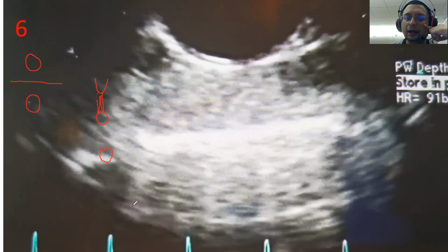But this time it will move the same way. If this structure moves there, this other structure also will move there. So that is reverberation. In mirror artifact, there is another structure that becomes the mirror and the image moves the opposite way. In reverberation artifact, you yourself are the reflector. And because the beam travels twice, once is your image, and one, two is the other image, so you have reverberation one there. If it continues, then you also have another one there. It should be the same size. I don't mean that the reverberation is fatter than the real one. It's just artifact.